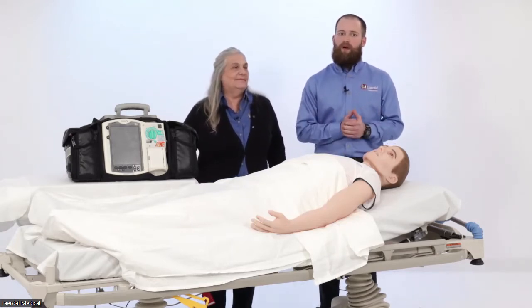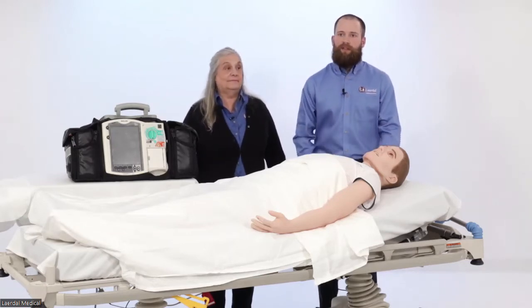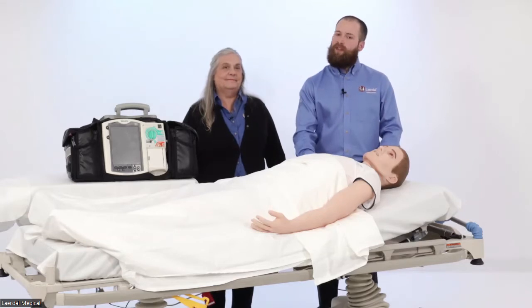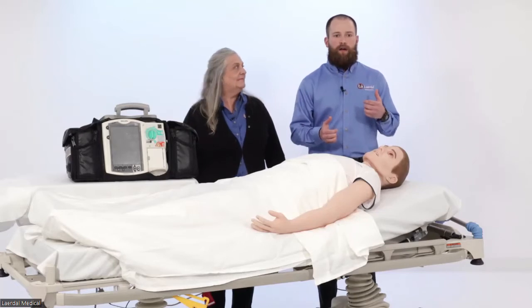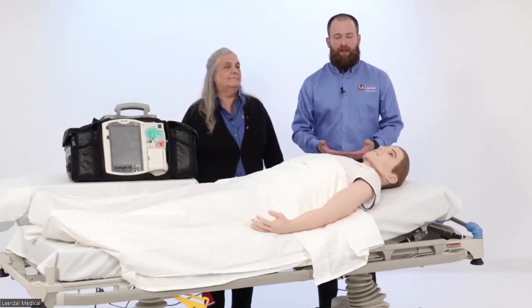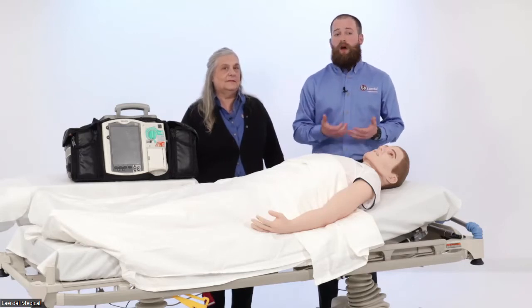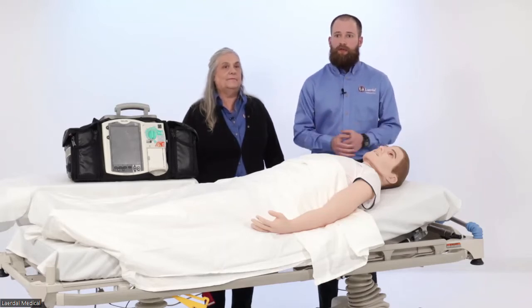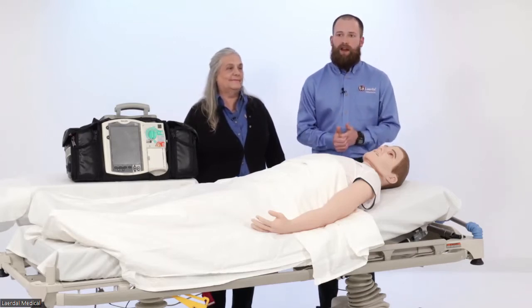To start, we had a couple of questions come in regarding the network connectivity solutions with SimMan 3G+. So just to recap a little bit, the internal router that used to come with the SimMan lineup now comes with a Wi-Fi dongle. It doesn't create the network, but becomes an access point instead. This allows a stable connection to an enterprise network. You can still hardwire the SimMan 3G Plus to a network, and you can still use an external router. Say you're doing in situ trainings, you could still have that as well, and we offer a router for that as well.